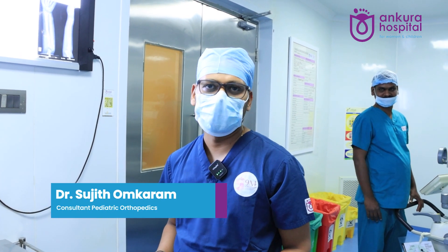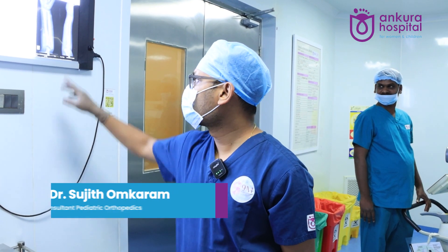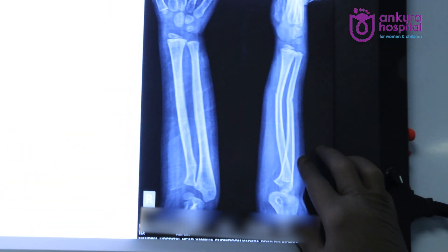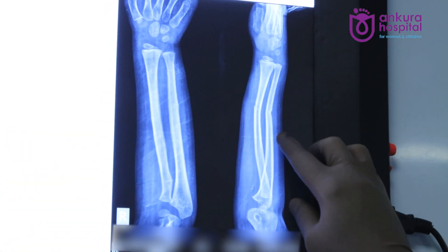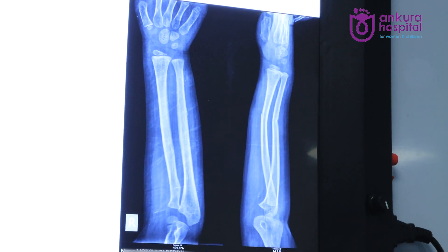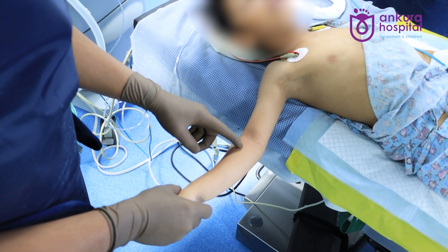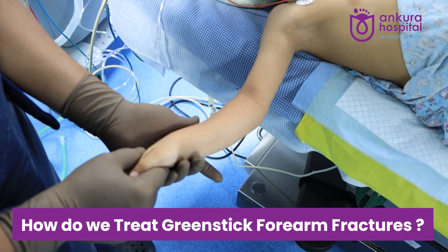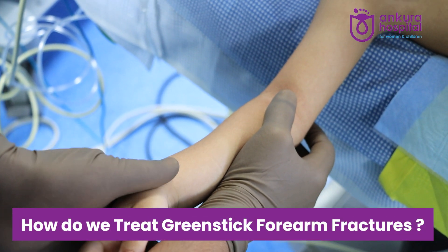A four-year-old child with a history of fall on outstretched hand. As you can see on the X-ray, it's an apex volar supination injury — specifically an apex volar greenstick fracture. We'll see how to reduce this. As you can see, it's an apex volar deformity, which is essentially a supination injury.